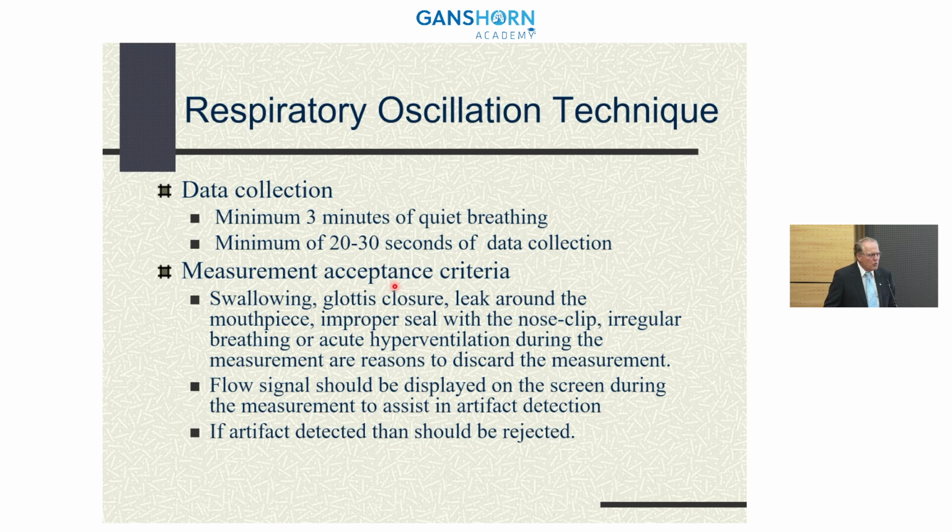But the important part of this is that we can characterize the airway with just quiet breathing. So in an individual that cannot take a deep breath and forcefully blow it out and do that successfully as we require from them in spirometry, with oscillometry, all they have to do is breathe quietly.